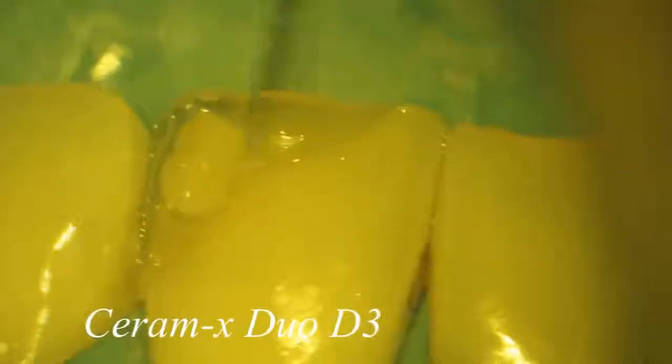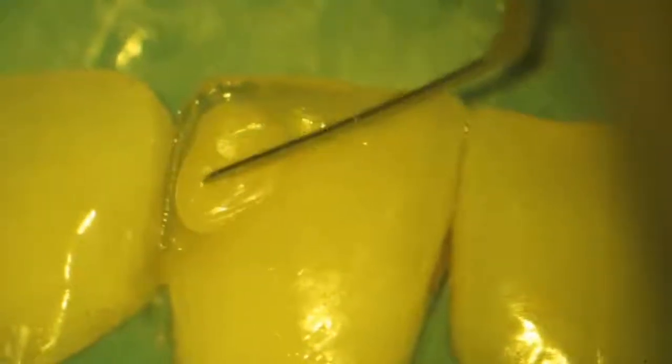Then a little bit more Ceramics Duo D3 for increasing of distal area of dentin core. Just a small non-transparent stripe made from Ceramics Duo D2 in order to reproduce the effect of hypermineralized dentin on the cutting edge.